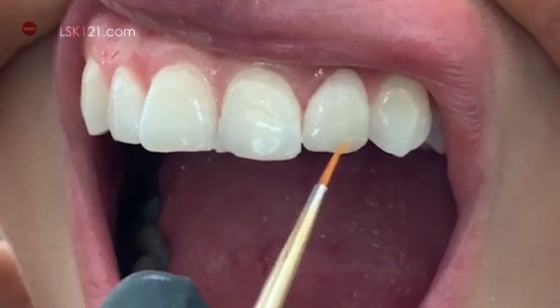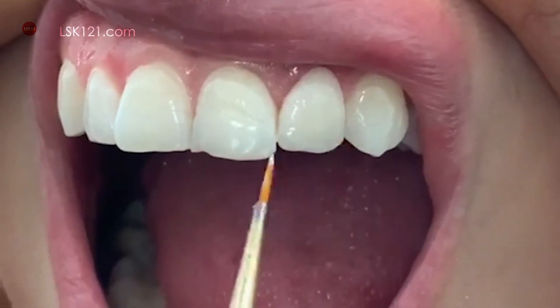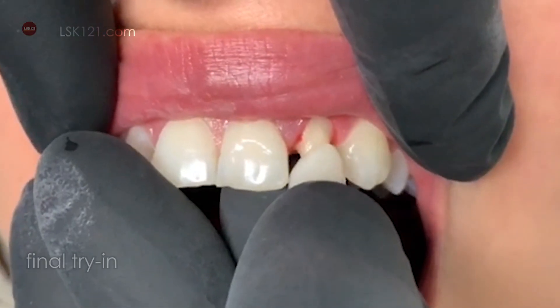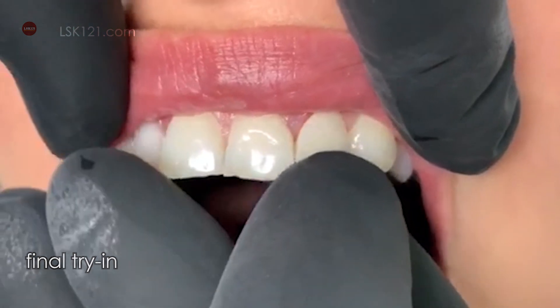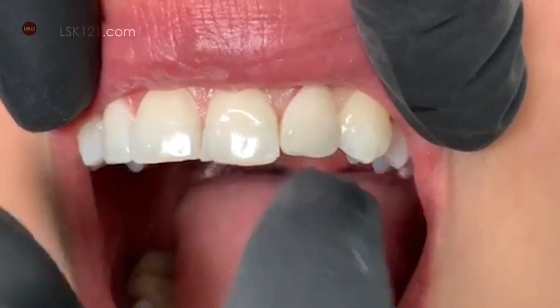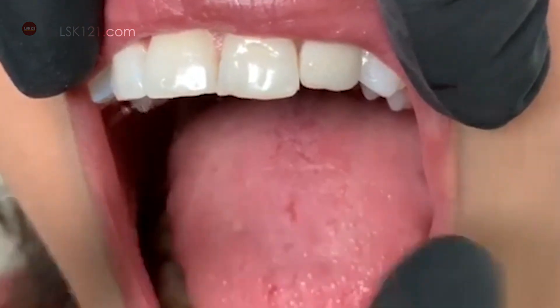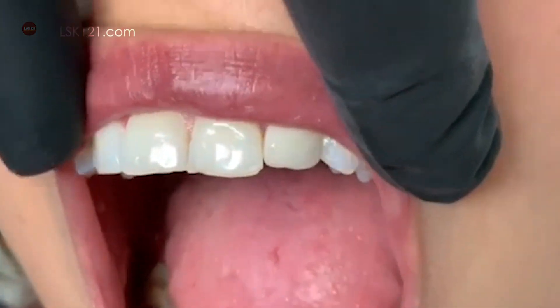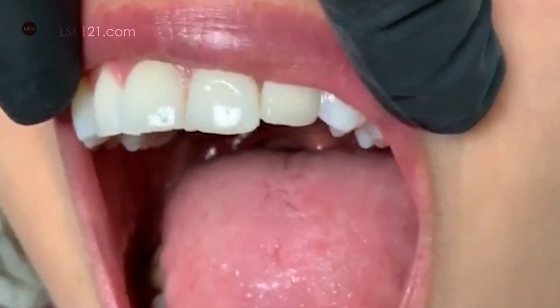So I use a little bit more here. Now I get it. I'll have her talk after I put some saliva. Can you chin down a little bit? Thank you. Could you put some saliva? Bite. Thank you — she has beautiful lips too.